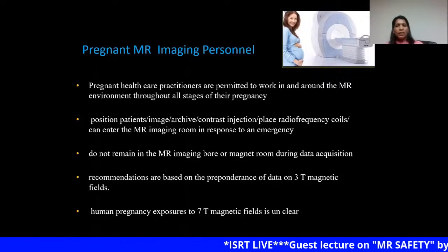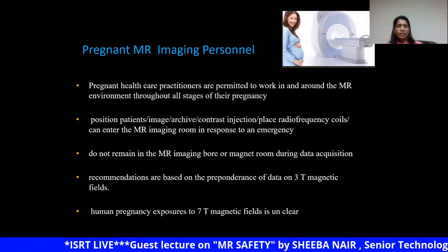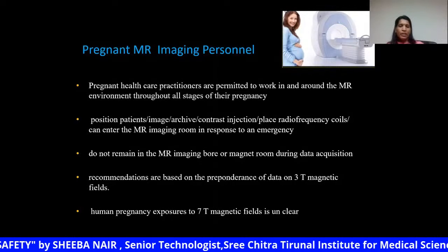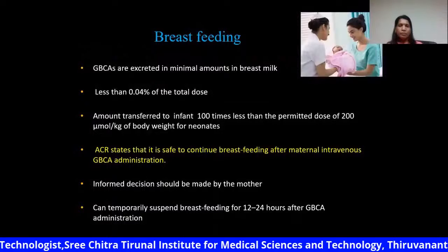But the only thing is that they should not enter the scan room while the scanner is scanning, that is, during the gradient switching. It is not recommended for pregnant personnel to enter the scan room.